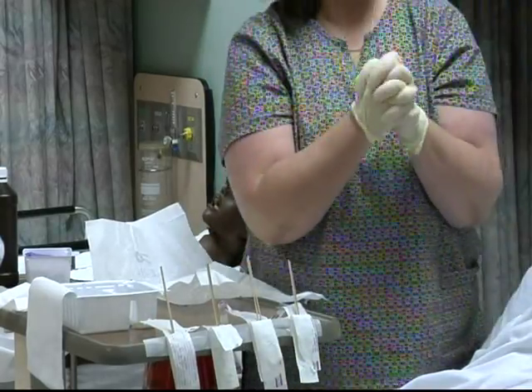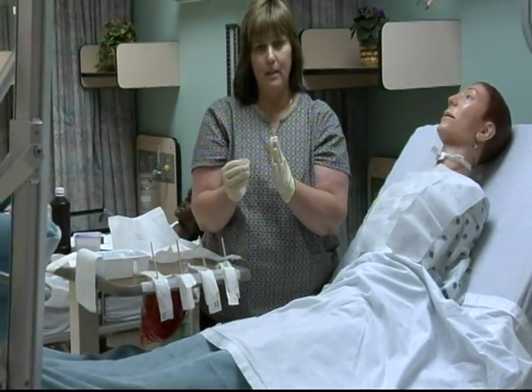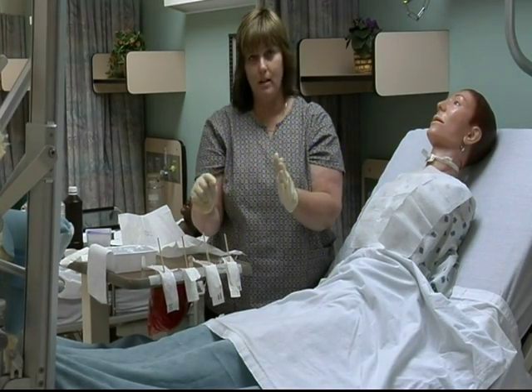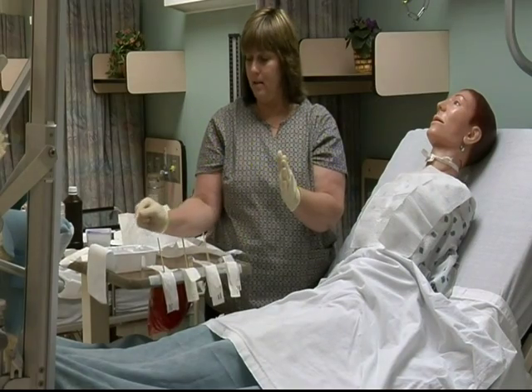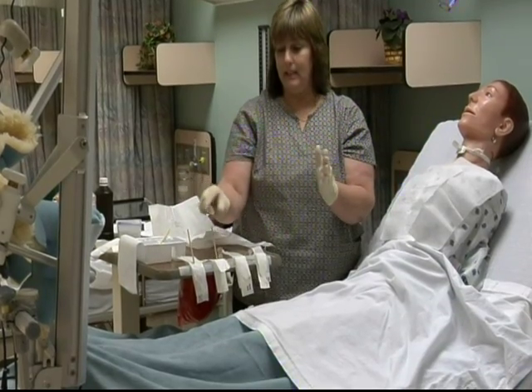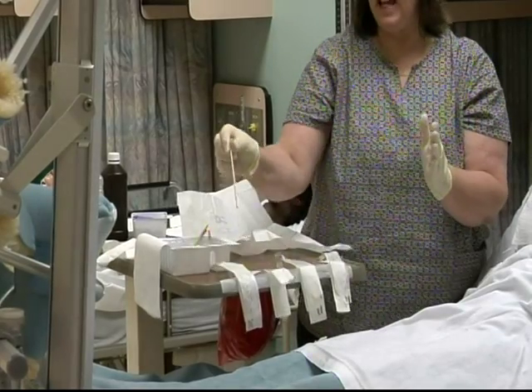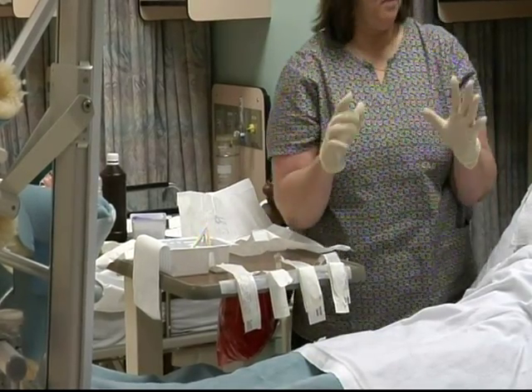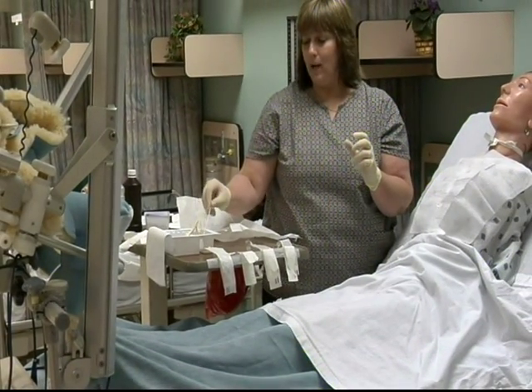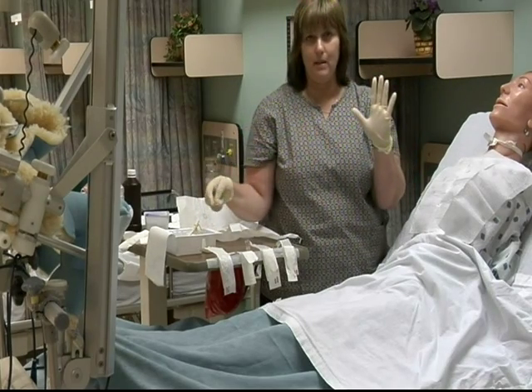Okay, gloves are on. Now, we opened our Q-tips from the back to the front, but now since we are sterile, you want to get your Q-tips from the front to the back so you will not contaminate them. So take 2 of these, place in your normal saline, take 2 more, place in your normal saline, take the next 2, place in your peroxide, and then take the last 2 and place in your peroxide. Now be careful with your left hand. I am right-handed, so I will be using my right hand to clean with, but you do not want to touch the bed or your patient because this hand will be contaminated then.